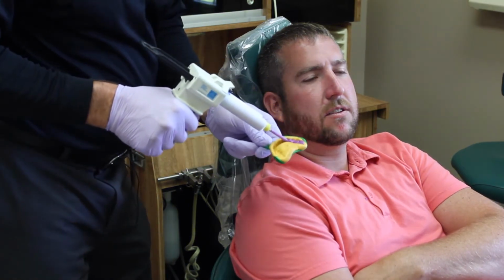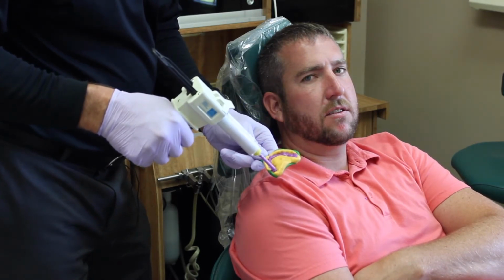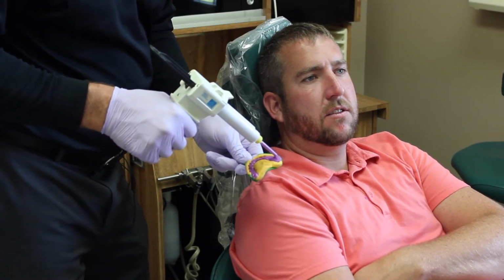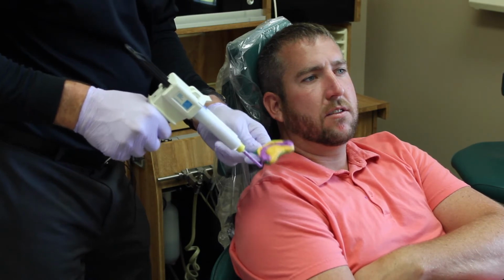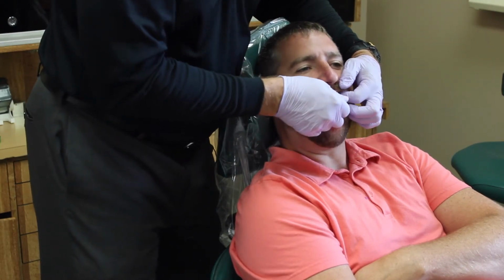So as I come along and I fill this tray, just like I would taking a good impression, I fill all the dentate areas very nicely. I realize I have some deficiencies, so I paint a little bit of extra material back there and a little bit of extra material back here. And let's see what we can get. Thank you, Jeff.